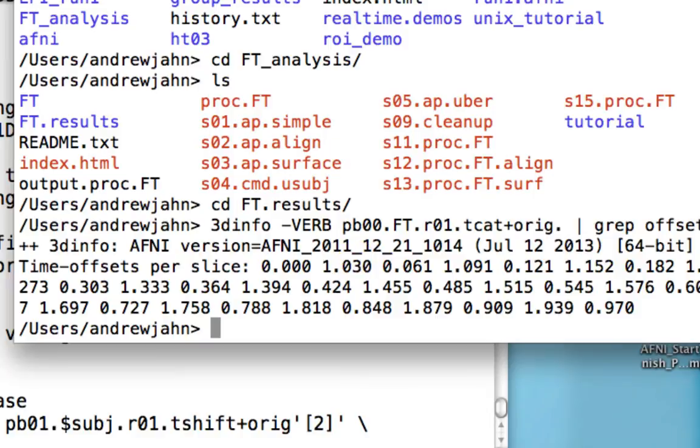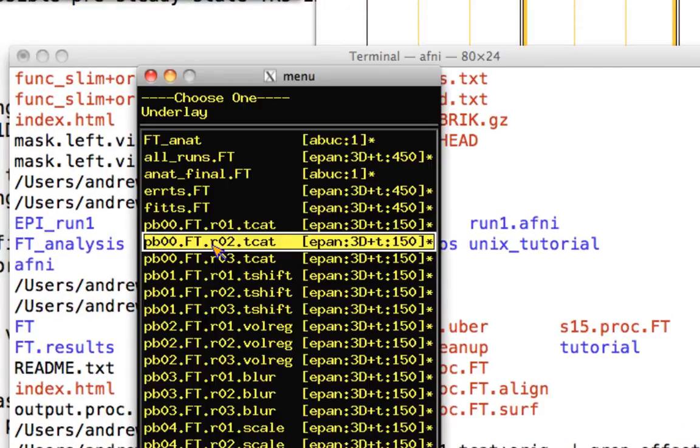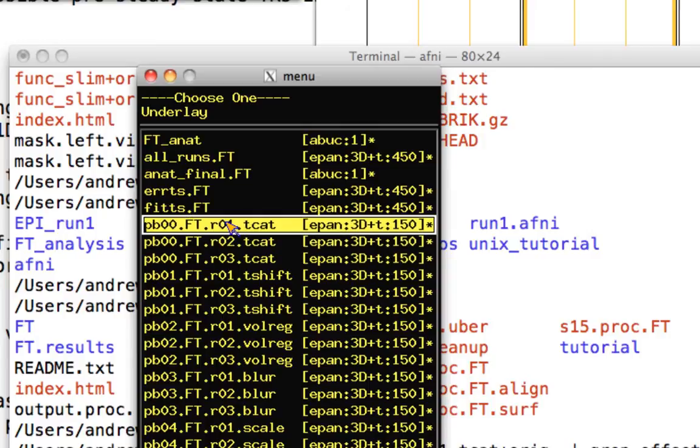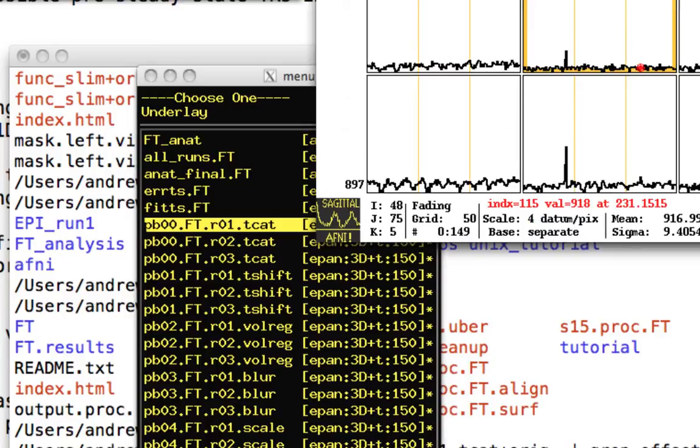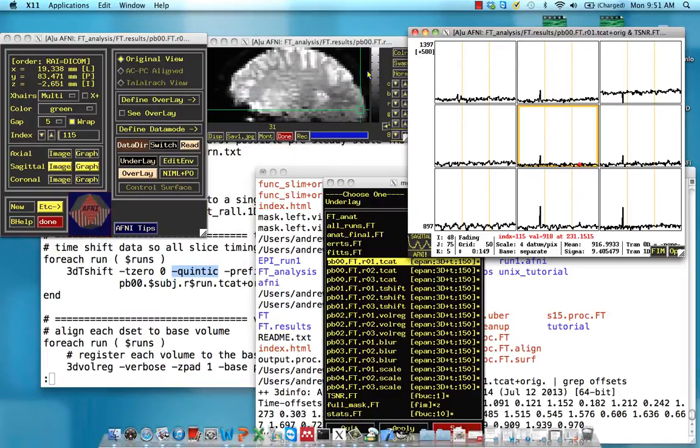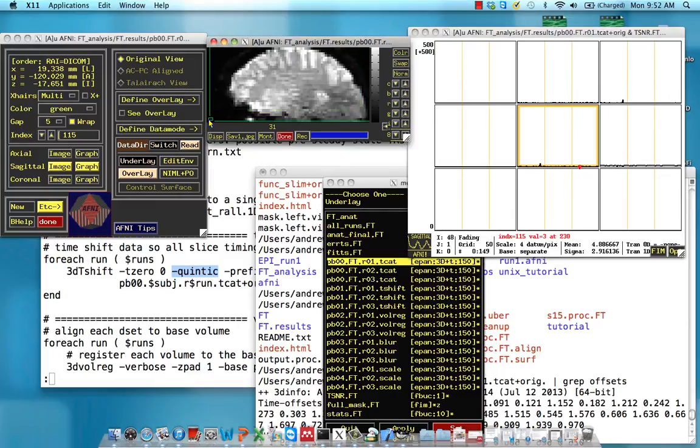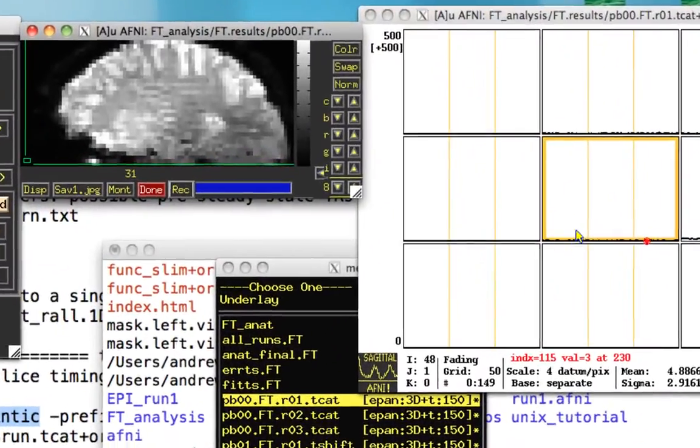So that's what that looks like. And if we look at this tcat image, before any slice timing has happened, let's go to a certain location here. Let's just go to this lower left location.